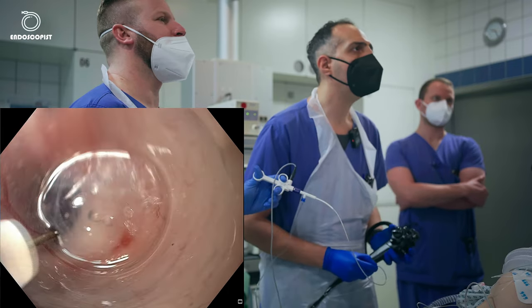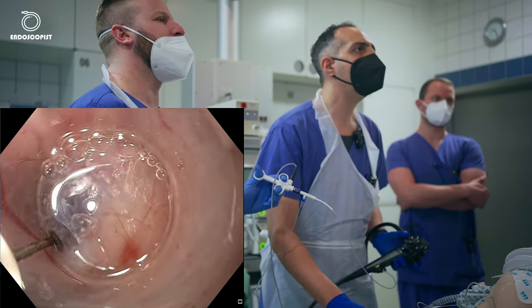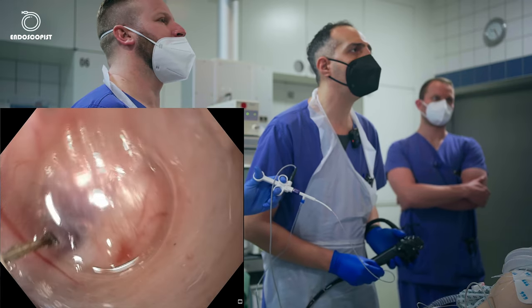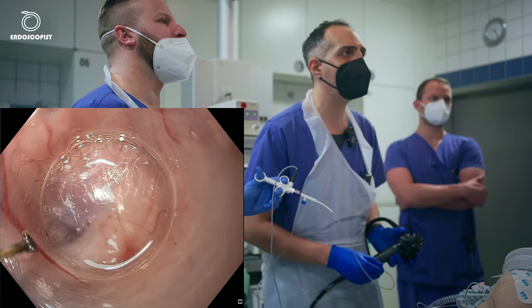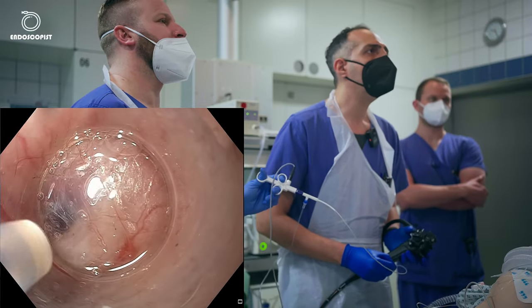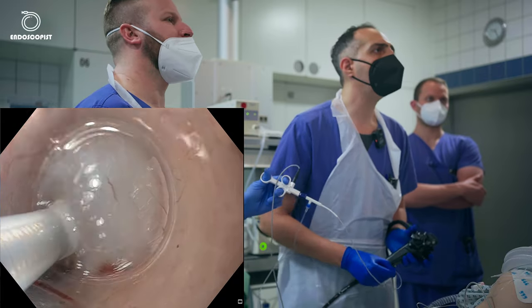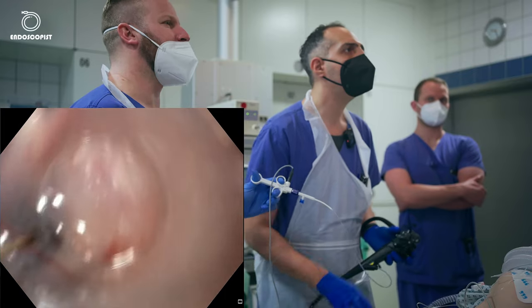I will try to keep the tip of the scope nearer to the muscle layer, because if I choose to injure one of them, mucosa or the muscle, I'll try to injure the muscle layer because we will cut it anyway. I'll try to expand our tunnel a little bit here so I will have some place.